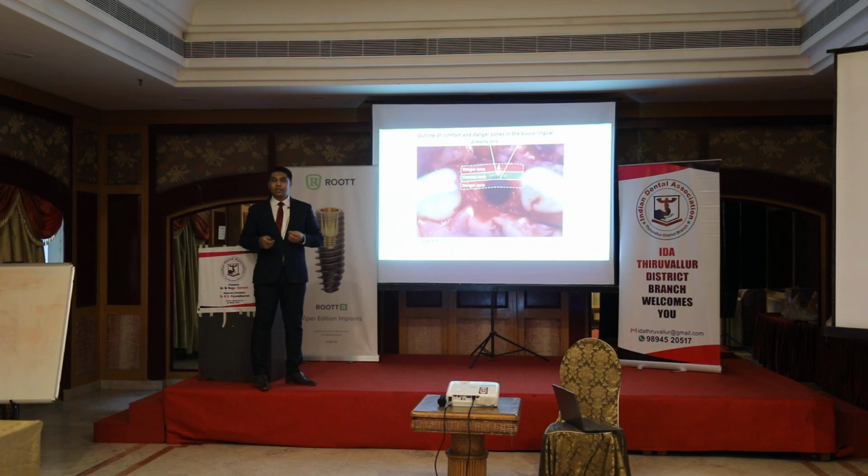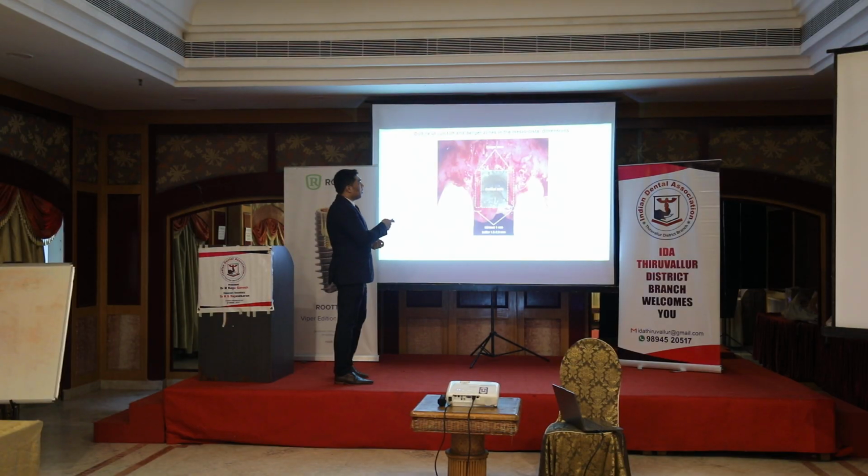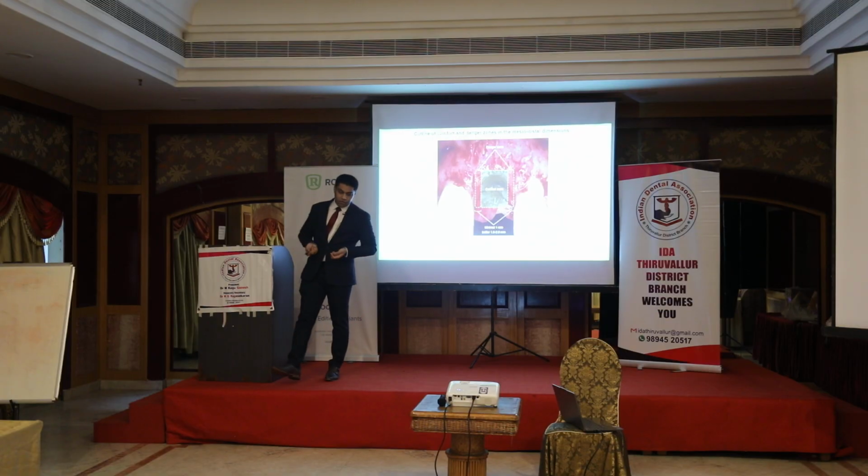So implantology is just about killing time if it goes wrong. And the patient, if they are cooperative, it's good. If not cooperative, it's too nagging to deal with such patients. So this is about the mesiodistal width, about the comfort zone, maintaining the blood supply of 1.5.